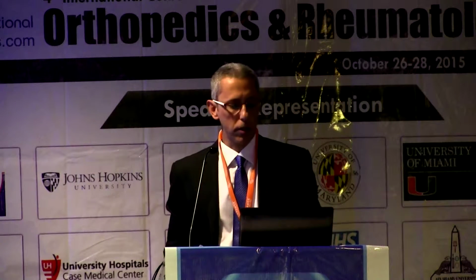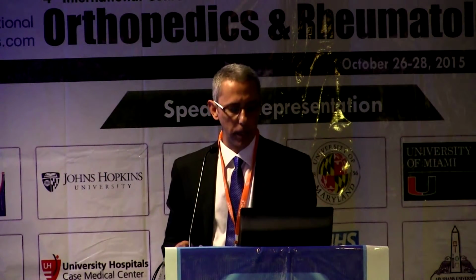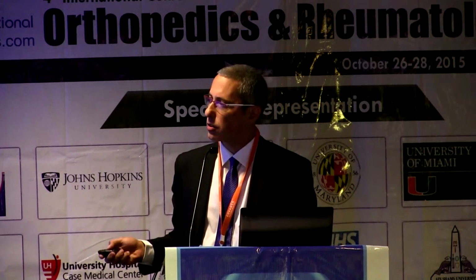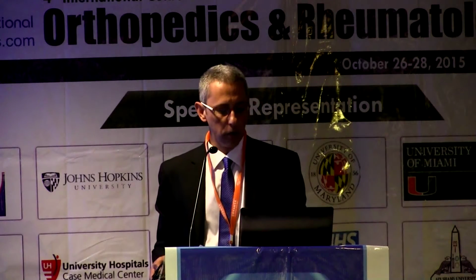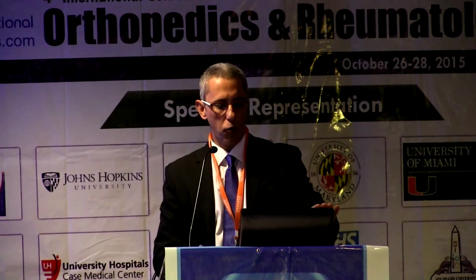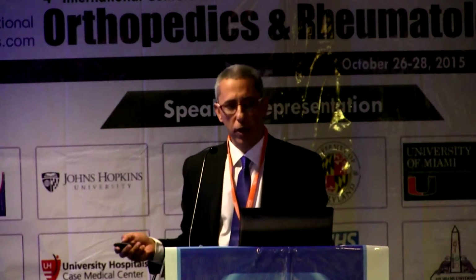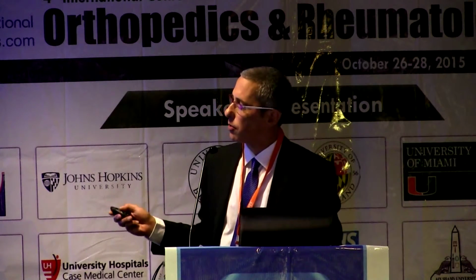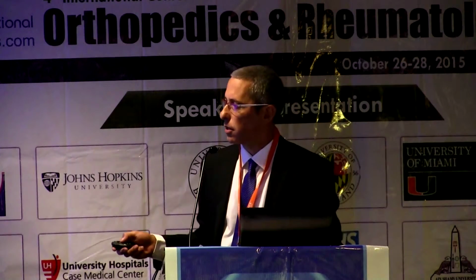From safety-wise, the device has no related adverse effect. Ultrasound done at 3 months after surgery, no significant implant dislocation, which means this balloon is stable in place. An MRI at 3 years shows no significant finding, no bone cyst or any other problem with the device. If we look at the result of the function of the patient after 4 years, this is the Constant score, which we're going to elaborate later on.